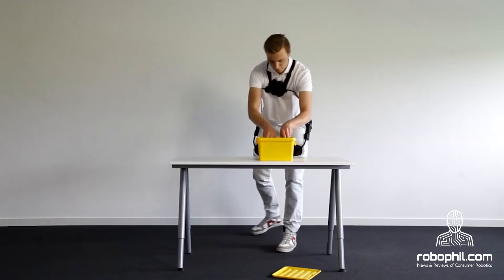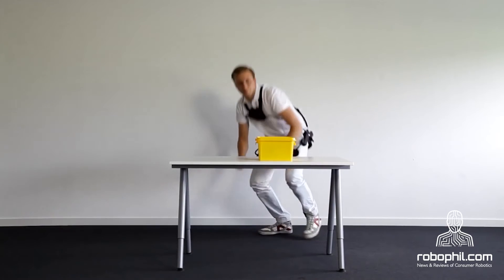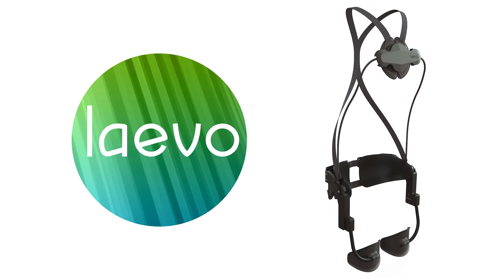Four, the hip pad supports the pelvis and results in the natural posture of the lower back. Five, the comfortable leg pads fit the upper legs. Six, the Levo parts are available in different sizes, allowing for a custom fit Levo, personalized specifically to the body and job requirements of the user.